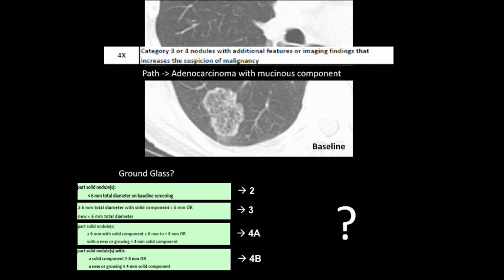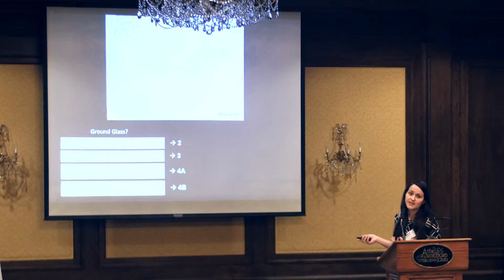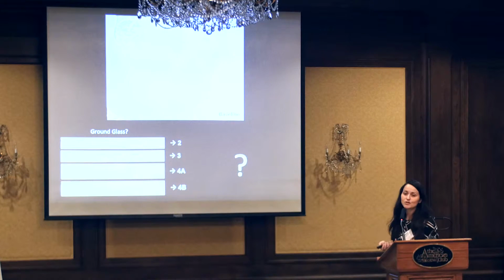This is an interesting nodule that we actually had shown to us this week. We are 3 chest radiologists in the academic division right there, and we emailed a bunch of people because we really didn't know how to categorize this nodule. Some people would say that's kind of a ground glass nodule. Some other people say, well, but it's solid around it. But how do you measure that solid component? Sometimes you're just not going to know how to do these things. All of us gave different answers on how to categorize this, and sometimes there's not a clear answer, and it's not right or wrong.